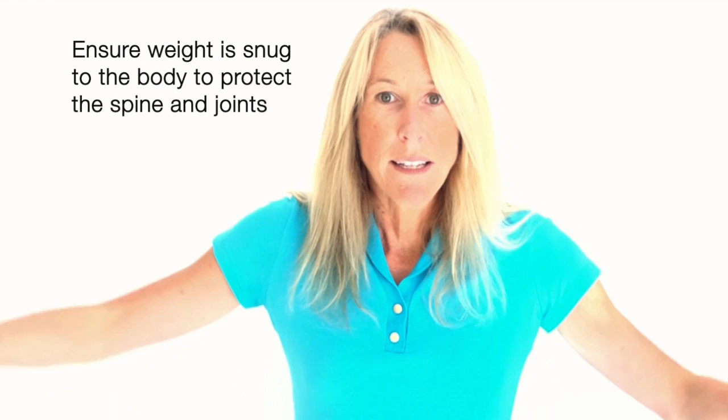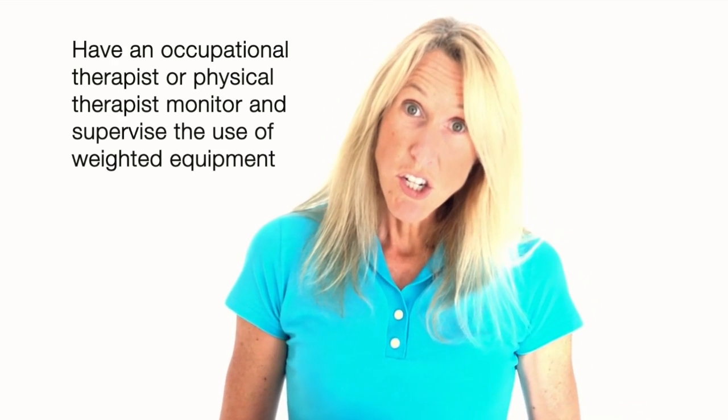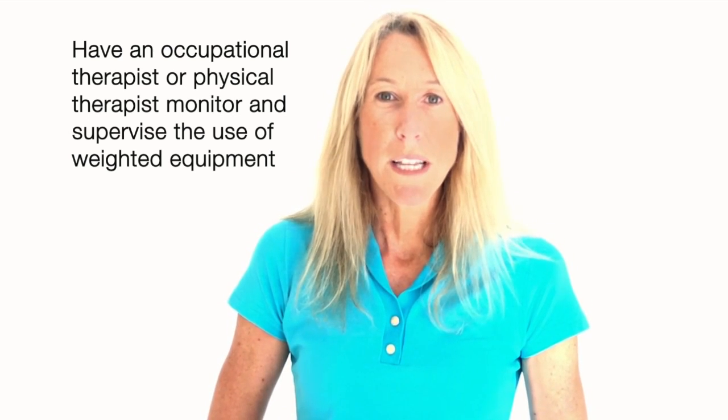We don't want things out on the extremities because we want to protect the spine. So when things are snug, it puts a lot less pressure on our spine and it's a lot more safe for their developing bodies. You really should have a therapist of some sort monitor weighted equipment. We don't want to be putting the spine at risk for developing any curvatures or scoliosis or any kind of muscle injuries to the spine.